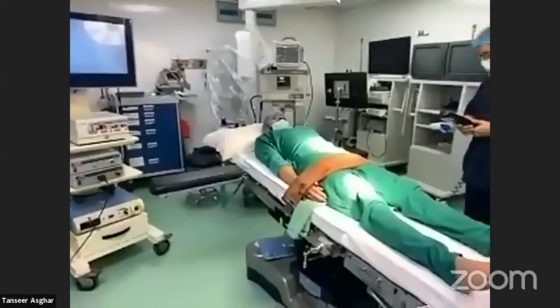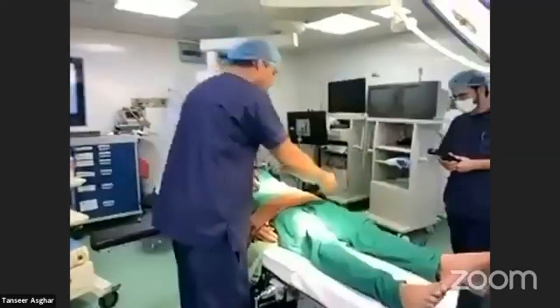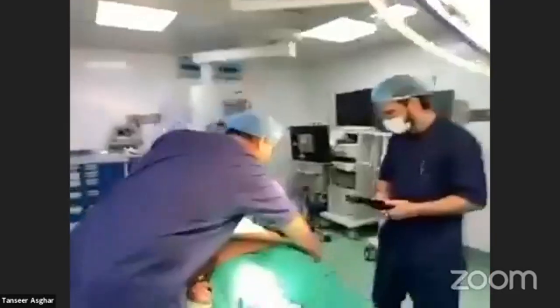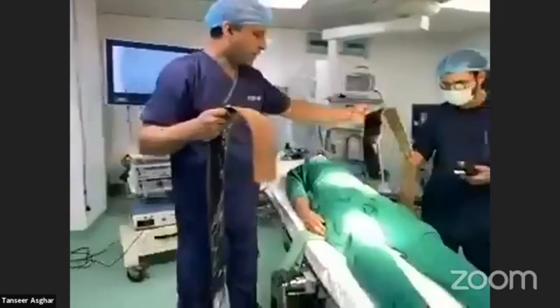There is another procedure position called the lateral position, which we use in kidney surgery. The patient is placed on their side and made comfortable.